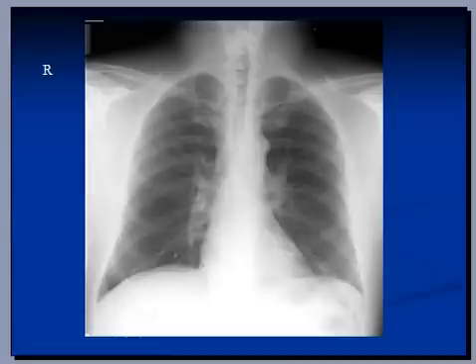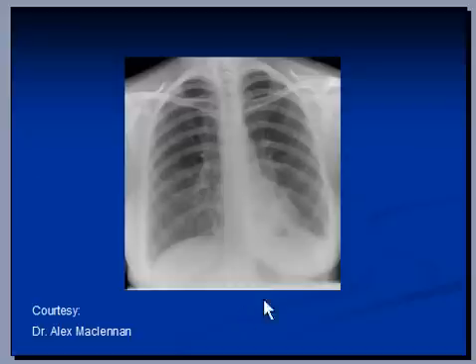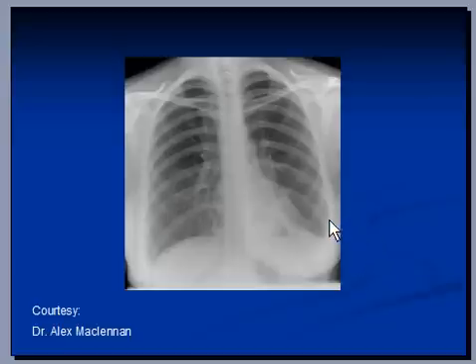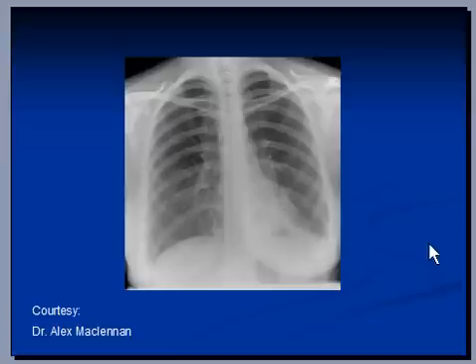If you look at this X-ray, the left costophrenic angle is blunt — it is not visible and not as clear as it should be. So this patient has a small amount of left-sided pleural effusion. Also notice there is an area of consolidation here, which is probably causing the pleural effusion as well.